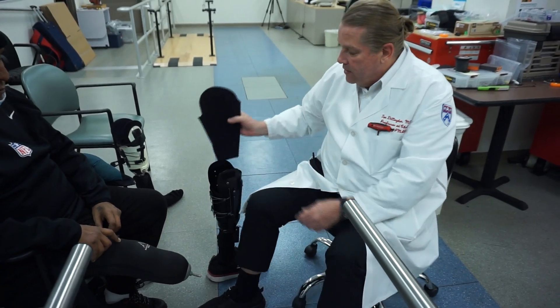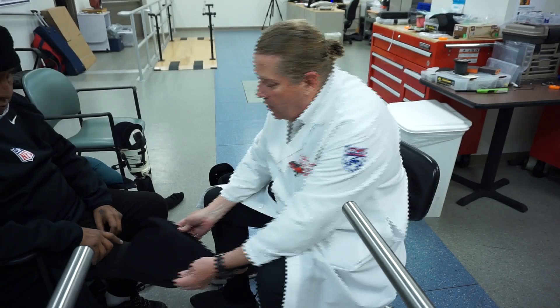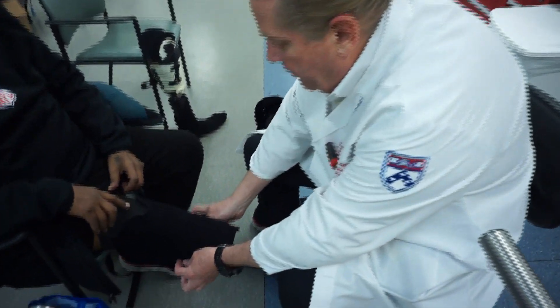This is the liner that goes inside the prosthesis. You just pull it out and you can lay it over the person's leg as such.